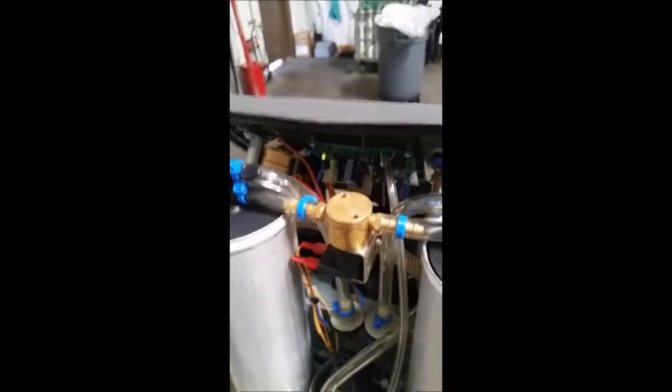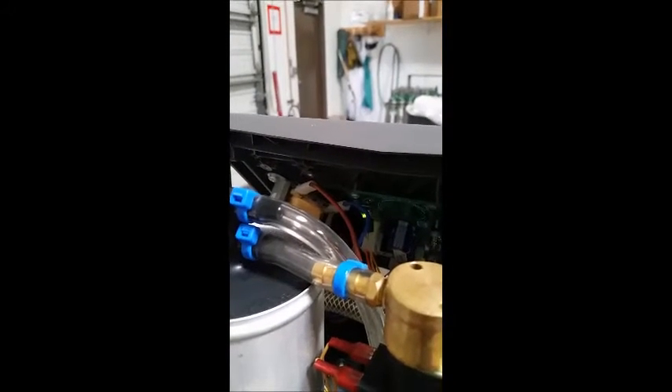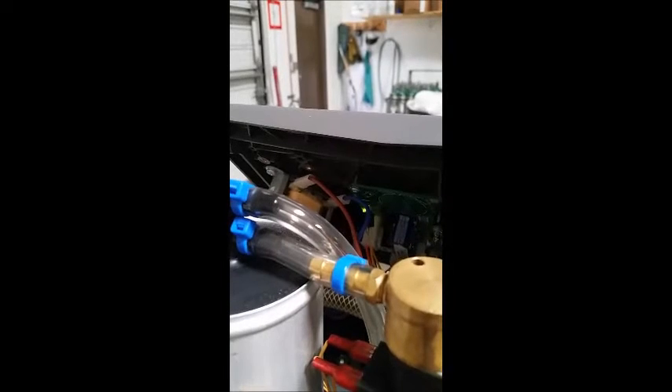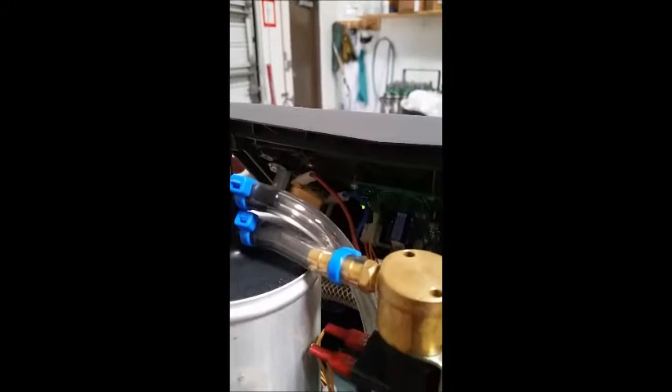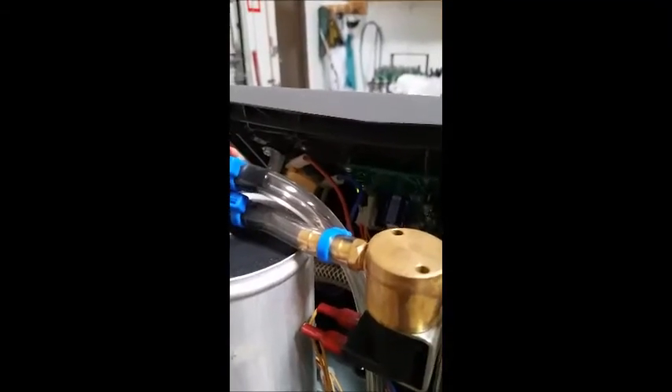This concentrator is currently leaking. You'll see back here we've got a code going off that is one green and one red, and it's going to alarm here shortly. We're going to show you how to detect and fix this leak.